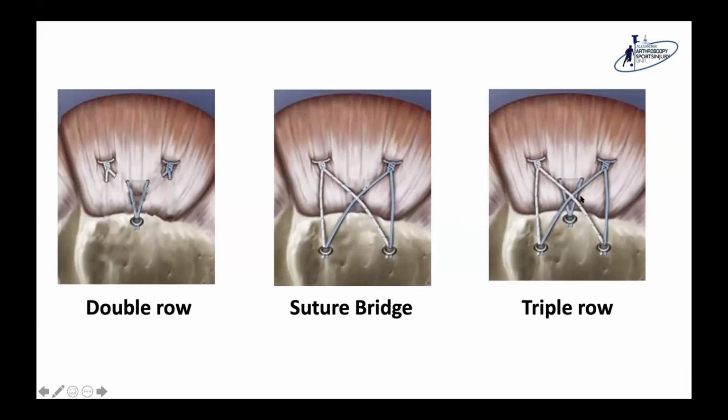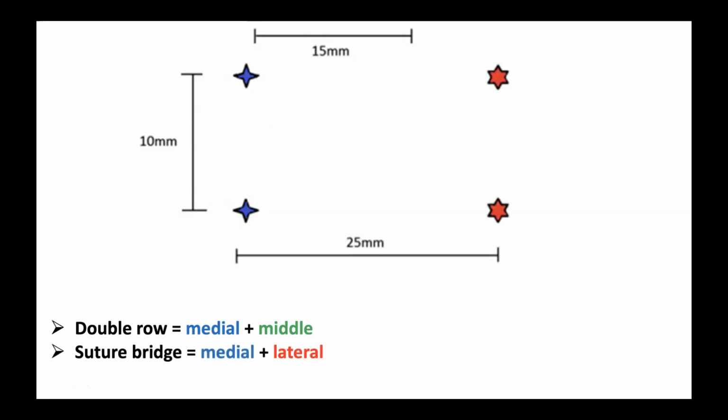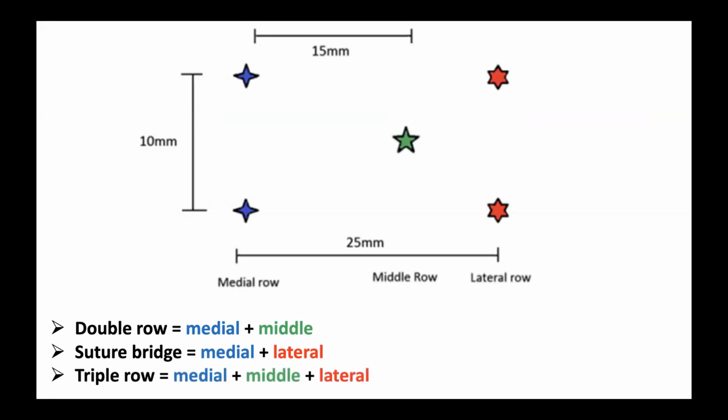And this is the triple row, when you're inserting a third row of fixation independent from the two other rows to decrease the tension in the construct. So this is the double row schematic diagram, medial and middle anchors. This is the suture bridge, medial and lateral anchors, and the triple row with medial, middle, and lateral anchors. This is the originally described triple row.